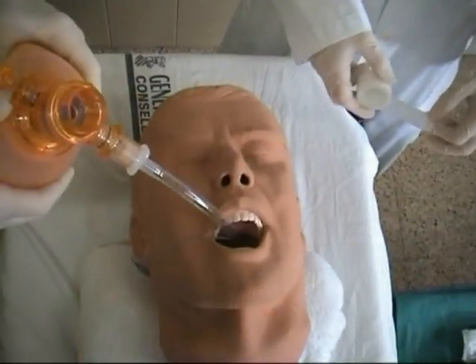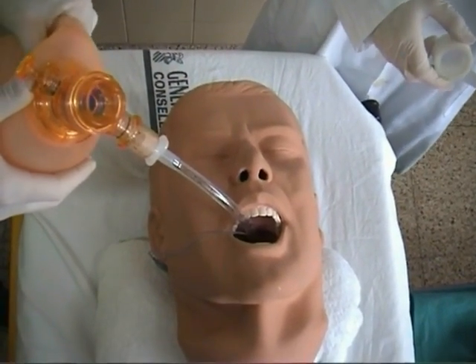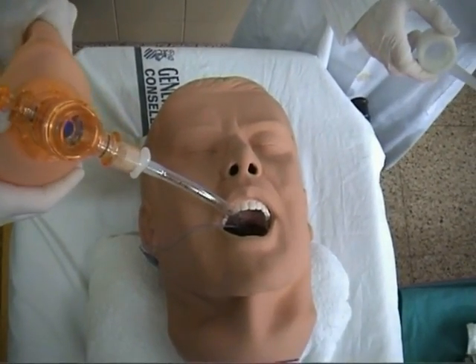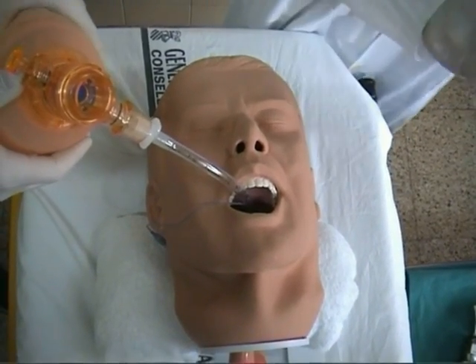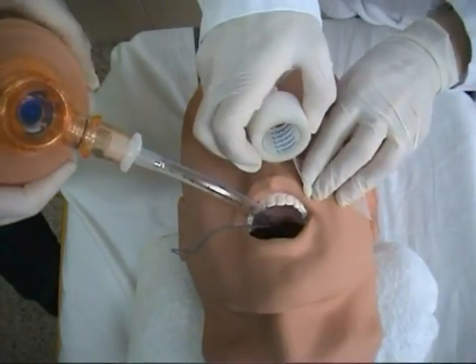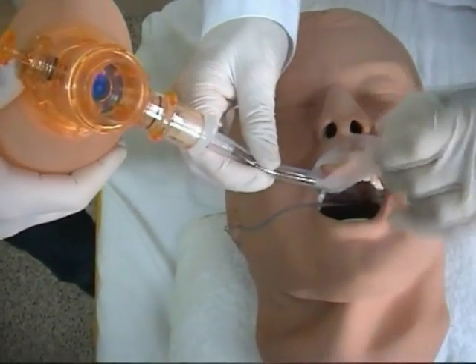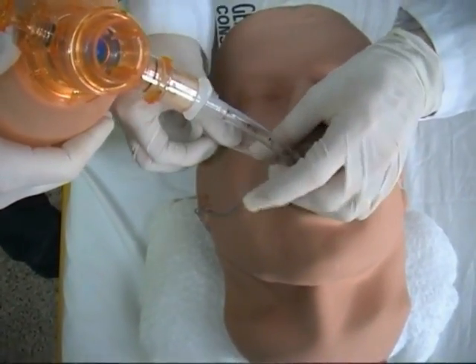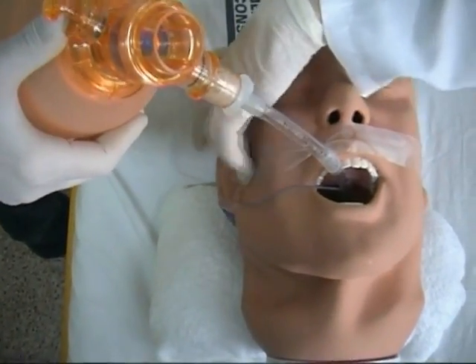The last step is to secure the endotracheal tube to the patient's head once proper position has been confirmed using tape, or if available, an endotracheal tube holder. Using tape, attach the tape to the patient's cheek and wrap it circumferentially around the endotracheal tube, and next fix the free end of the tape to the patient's other cheek.